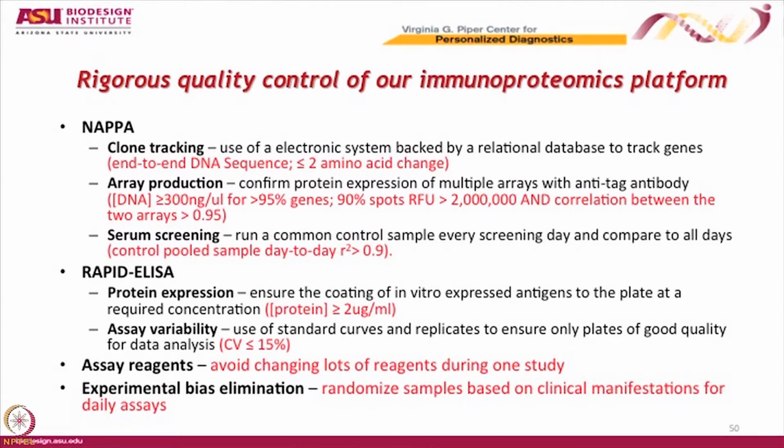One of the things I will caution you about is this little subtle point down here that a lot of people forget to do, and it can really come back and bite you if you forget to do it, which is to randomize your samples when you do your assays. I can't tell you how many students I've had come to the lab, and they will do all of the cases today, and they do all of the controls tomorrow. And they think, all right, I did it right. It's like, no, because they will get big differences. And they say, look, I found something really cool. And it turns out the difference is because they did all of the cases on one day and all the controls on the other day.